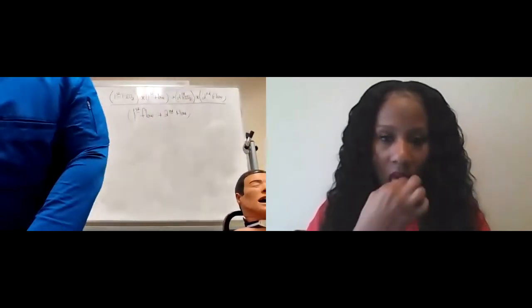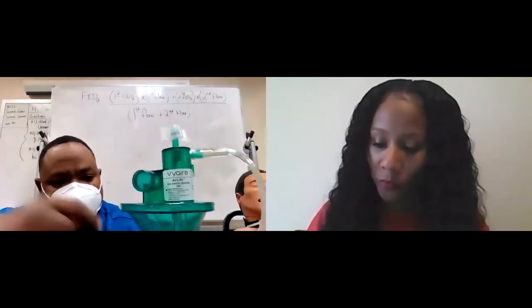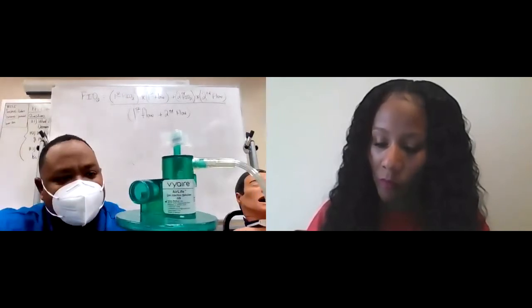When I have that situation, guys, I have to use what's called a GIN. Now, on this one, I didn't have one with the oxygen in the air, and my blender is old and doesn't work. But I got another one over. I'm going to show it to you. The GIN nebulizer is called a gas injection nebulizer. It's this green part here. Let me unscrew it. It's this here. This is a GIN, gas injection nebulizer.